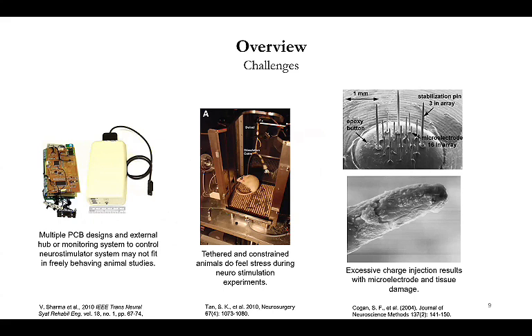So there are challenges for neurostimulation applications. The first challenge is that engineers and researchers design custom neurostimulators, but they are composed of multiple PCBs. It is a little bulky in size and shape, so it is not convenient to use with small animals such as rats or mice.